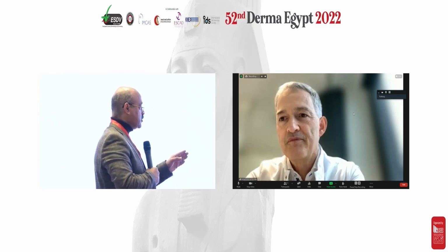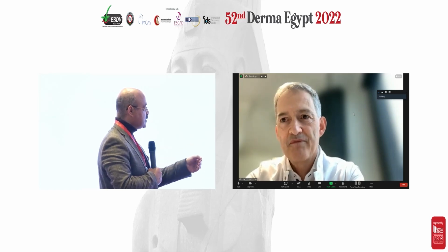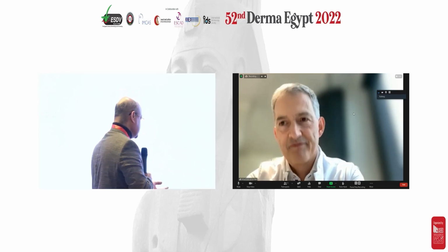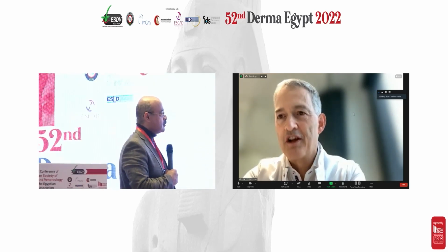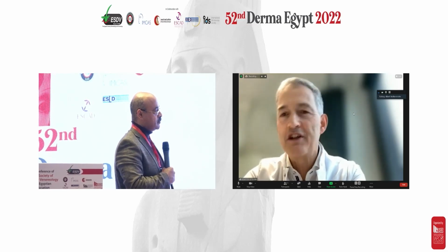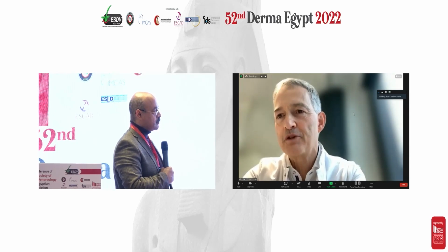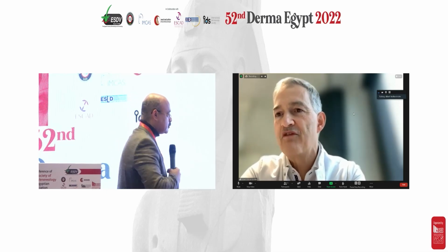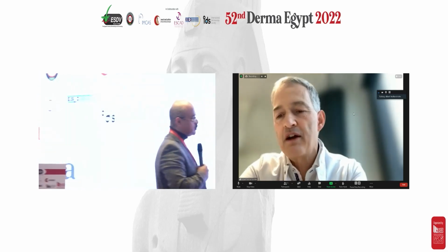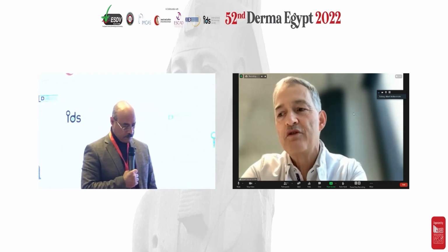For me, this is a little bit critical because if I have hyperpigmentation of the scar, this is PIH. And we know that PIH does not respond to the Q-switched laser well, or sometimes we have refractory hyperpigmentation. So what is your protocol in this case? The difference in color must be substantial, and you must not have a patient with a very dark skin type. But sometimes you have patients with skin type 2 or 3, for example with a burn scar, where the hyperpigmentation is the most visible part of the scar. Then I think a Q-switch laser can do quite a good job to improve the visibility. But of course, it will have no effect on the pliability and the thickening. Okay, perfect. I think you need to combine.